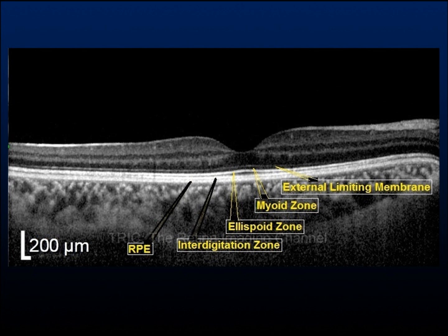The ellipsoid zone is followed briefly by a hyporeflective zone which is the photoreceptor outer segments. Then there are two hyperreflective bands: the inner band is called the interdigitation zone and the outer band is the retinal pigment epithelium.